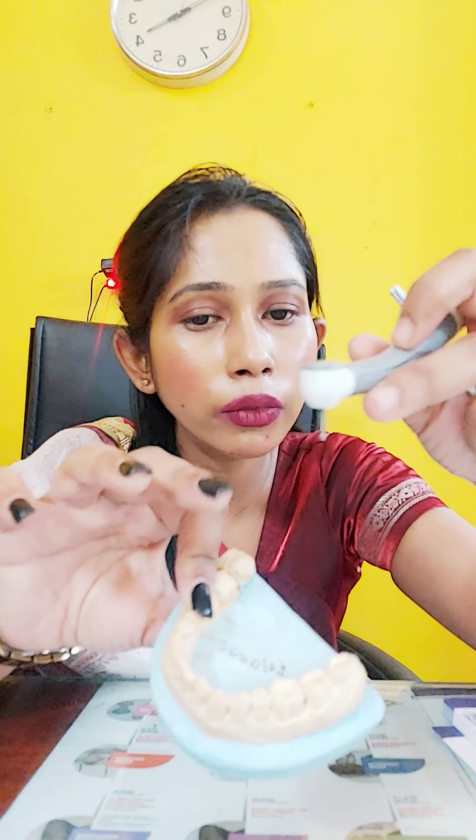The second hack is: if you don't have the Langenbeck retractor, we all use a mouth mirror. Suppose I am doing the lingual portion — this is my tongue area. I have to engage my air rotor here, and this portion of the diamond abrasive bur can lacerate my patient's tongue.